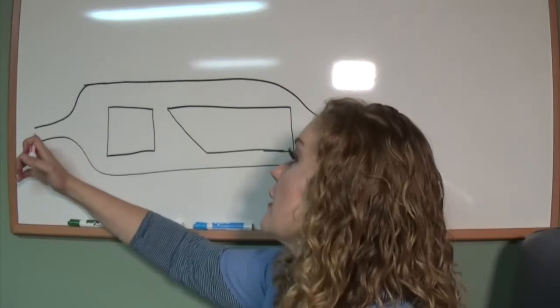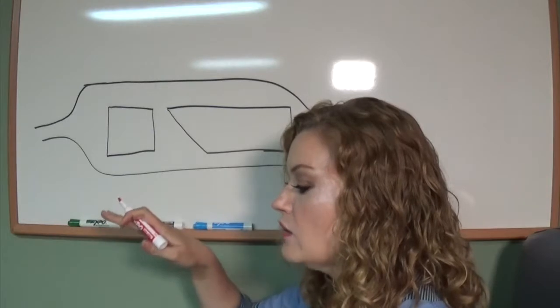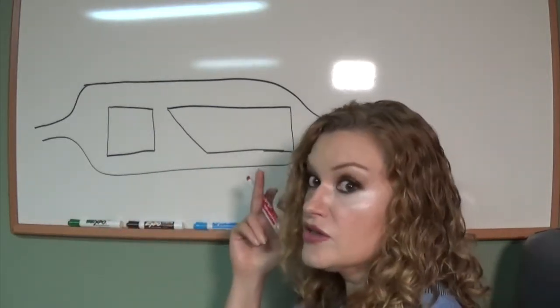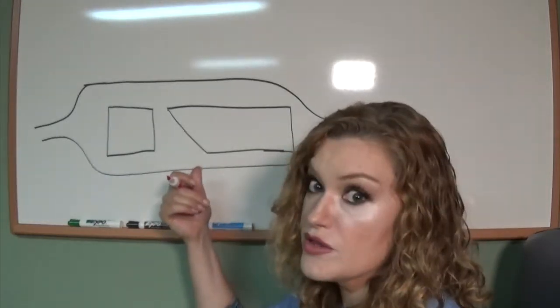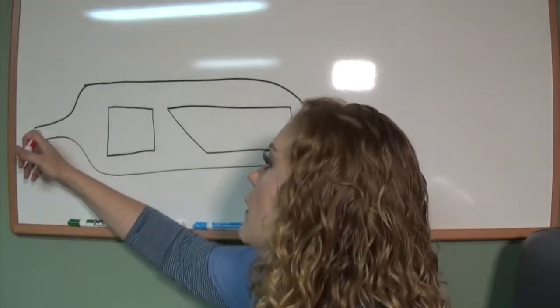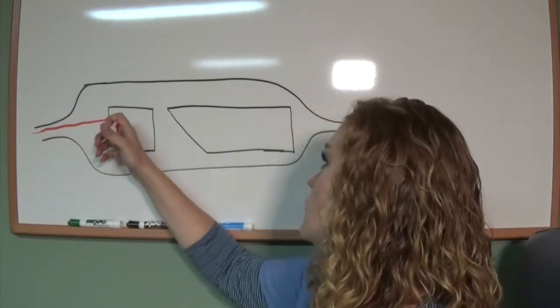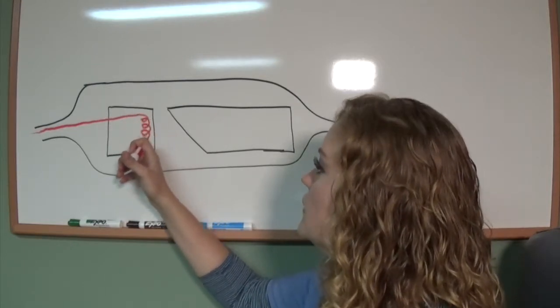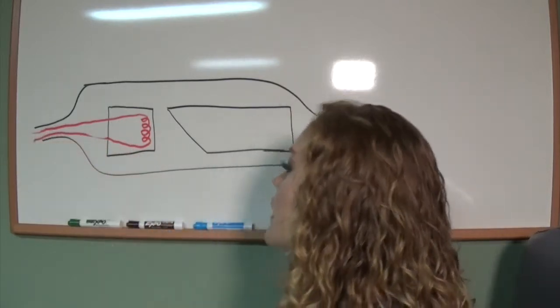So what ends up happening is, first, when you start depressing the pedal, you're going to go into standby mode. That is when you hear the anode starting to do the noise. All that is the anode spinning if you have a rotating unit. So the electrons are going to come in through a wire. So this is a magical wire. And then they're going to do this fun little spinny thing. And then the wire is going to exit out of the glass envelope.